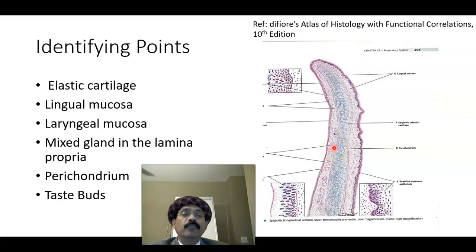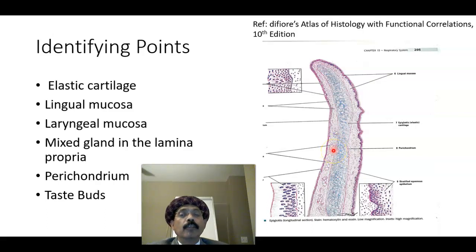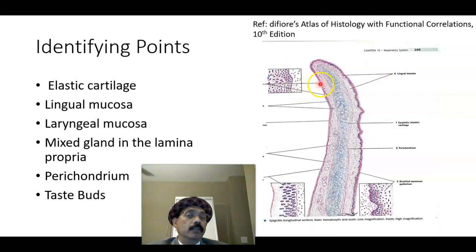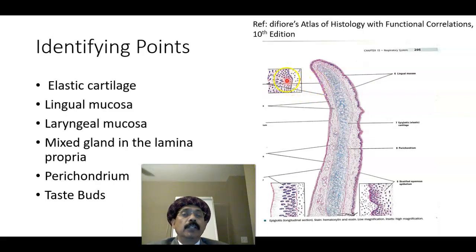The glands may be mucous, serous, or seromucous. They may be tubular glands. Taste buds are the modification of the ectodermal tissue and these are the receptors for taste.